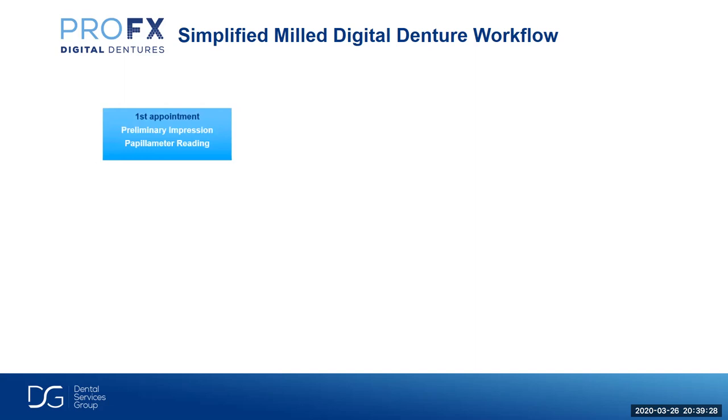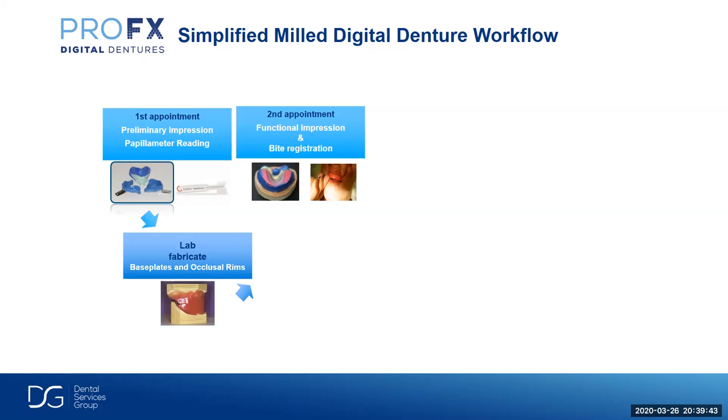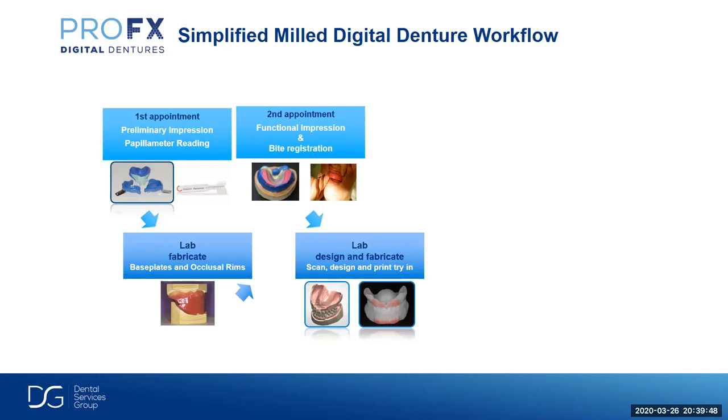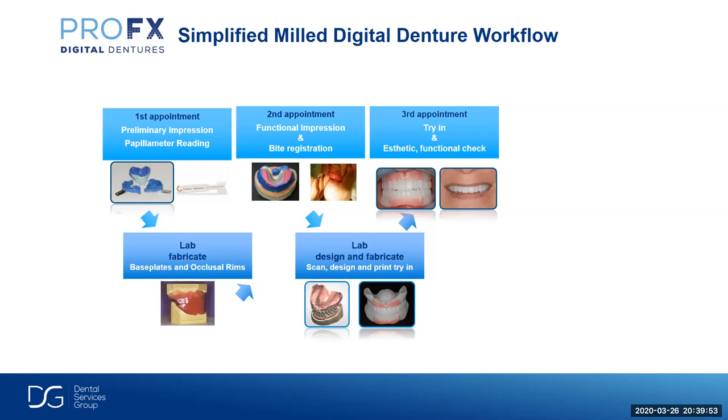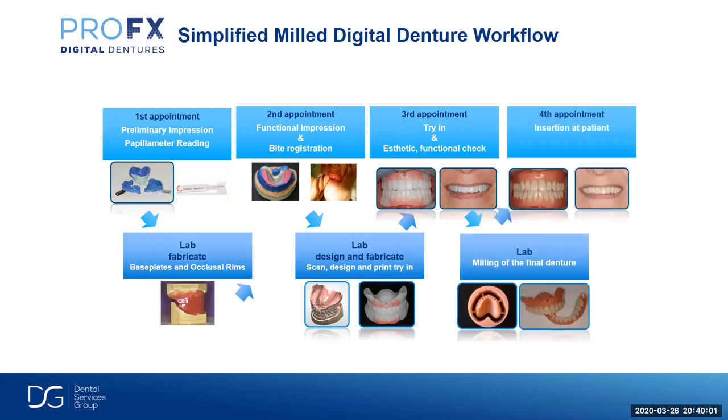The first appointment, we're going to take the preliminary impression, and then we're going to ask for a papillometer reading, and I'll explain that in a minute. Send it back to the laboratory. We're going to make a base plate and occlusal rim. And then on the second appointment, you're going to take a functional impression inside the base plate and a bite registration. We'll design and fabricate the printed try-in, send it back to you for that third appointment, where you can check for aesthetics and function, and then send it back to us at the laboratory, and then we'll mill that final denture. And for the fourth appointment, we have the insertion of the denture.